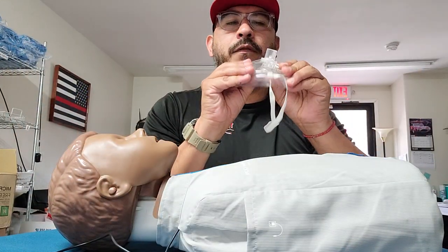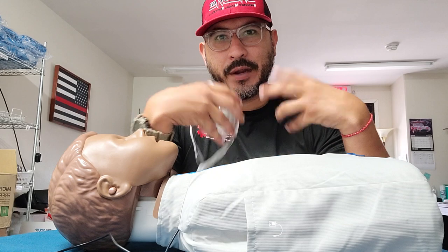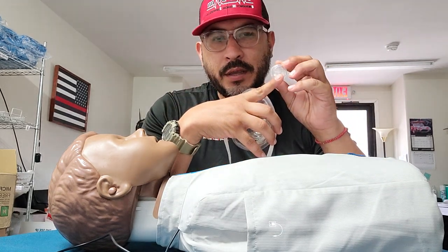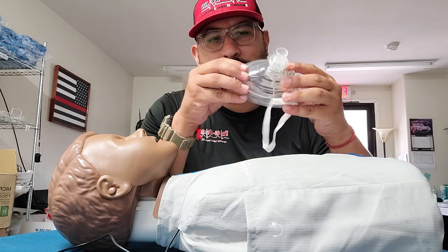This one-way valve means that when you breathe into the patient, the air is going to go into the patient's lungs from your lungs, but the patient is not going to be able to breathe back into you or your lungs. So whatever infection they have, like I just mentioned, it's not going to be passed on to you.